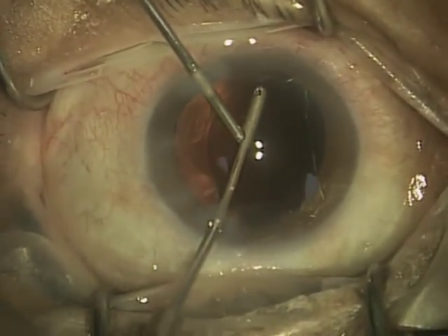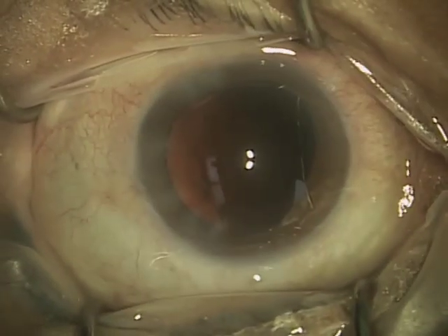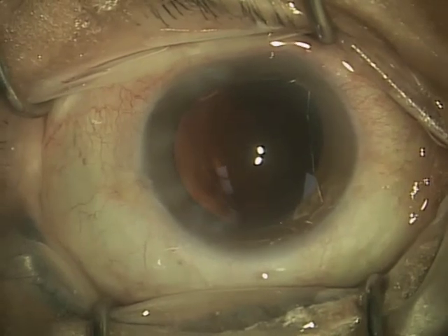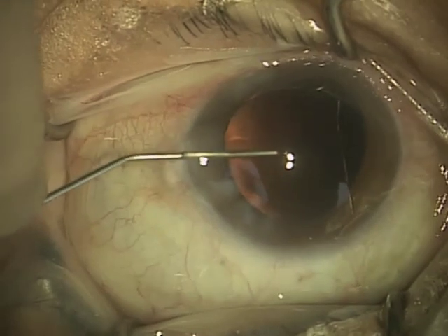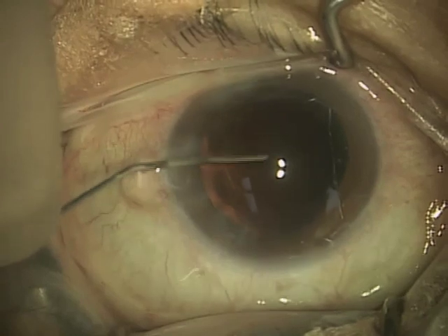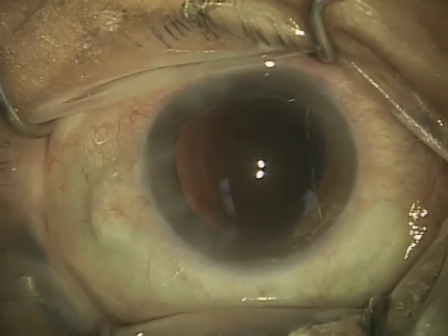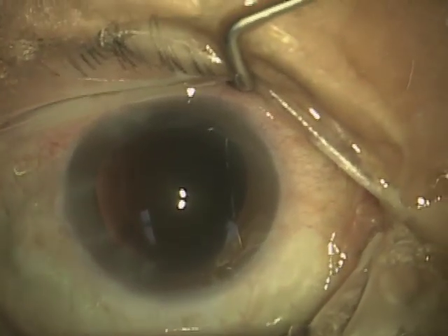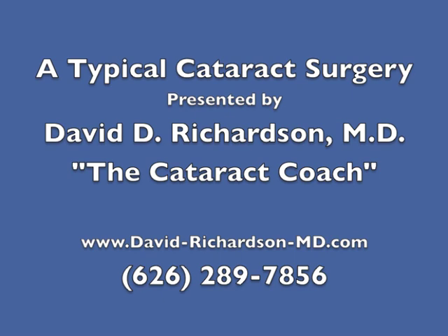The next step, you'll see, I will actually place some viscoelastic into the capsular bag, and that frees up a space that I will then use to insert the lens. So here's the viscoelastic, and it's transparent, so you can't really see clearly what's going on here. But I've just filled up the eye with a viscoelastic gel, and this is going to let me place the lens in safely, which I will show you in the next and final segment of a typical cataract surgery.